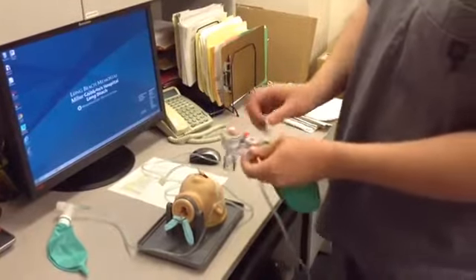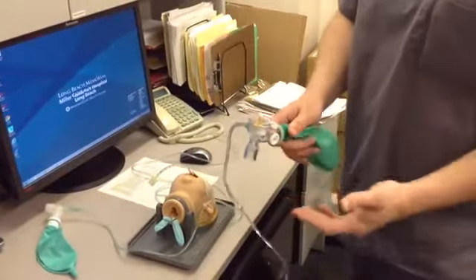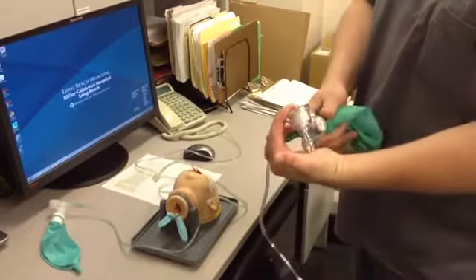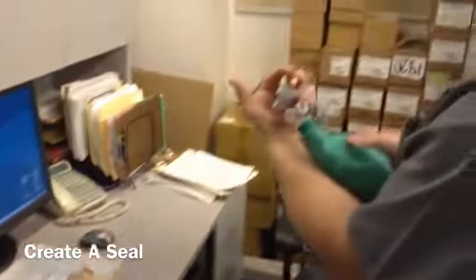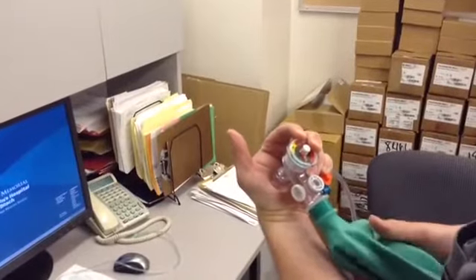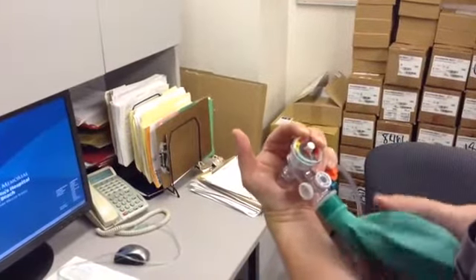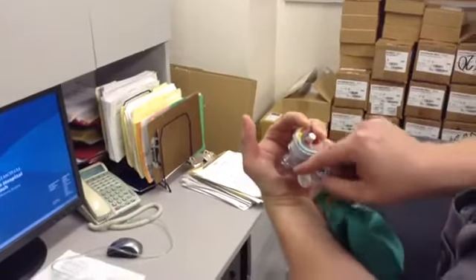Now when you first open this bag, you're getting ready to use it on the patient for the first time, or you're waiting on your patient to arrive, what you're going to do is seal off the bag, and you're just going to start bagging. Your flows, in my patient population in the NICU, it's about 5 liters, but the bag can go up to about 10 liters.